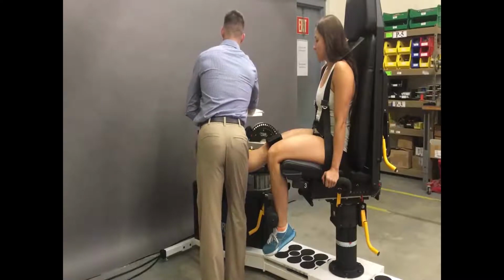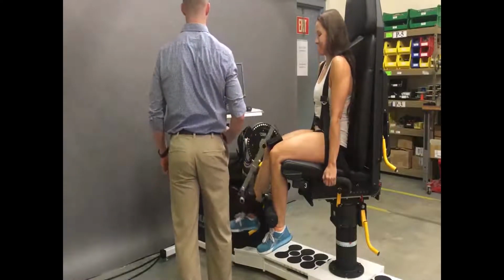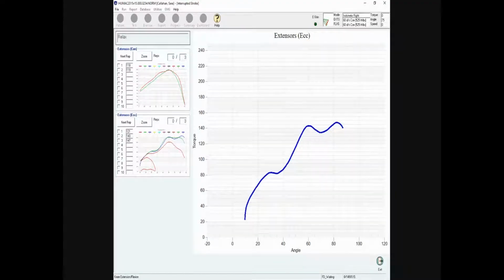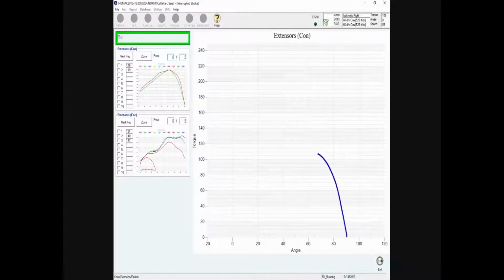And also you'll see that the patient many times will get more and more torque as they go, and you'll see that with her as well. Now lots of times you'll see that torque get higher because unless that patient has been eccentrically loading at maximal effort, which typically they won't if they're coming to see you, that neuromuscular inhibition that they have goes away as they load rep after rep. So it's kind of a neat phenomenon to see.